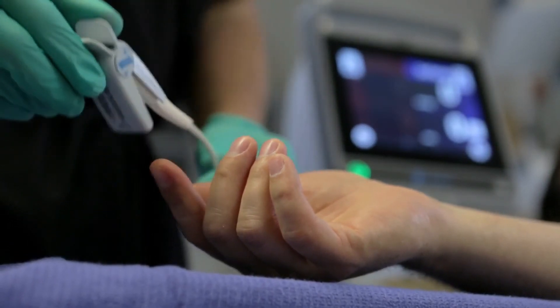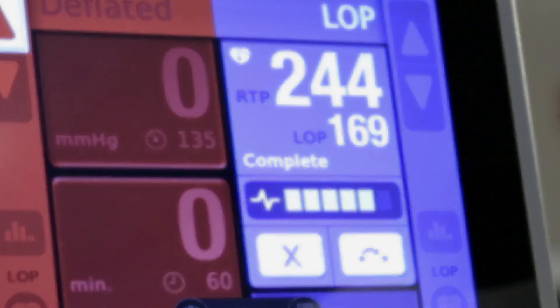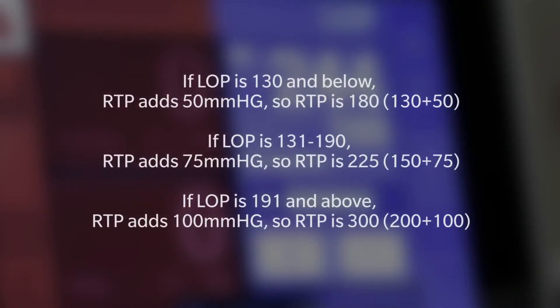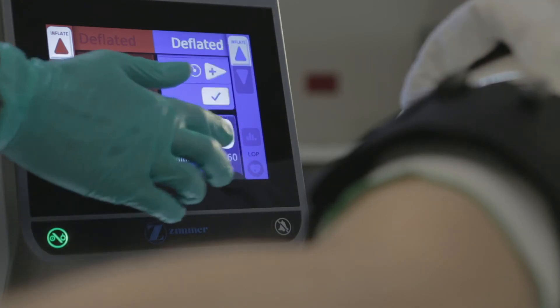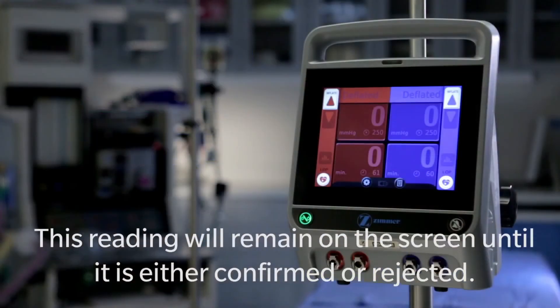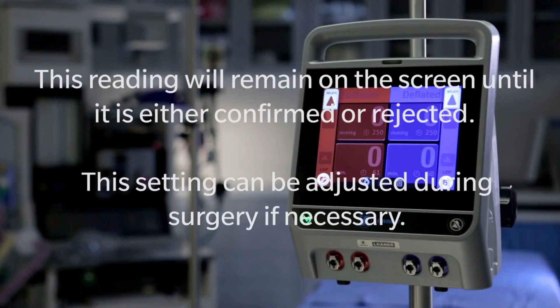The LOP pulse sensor can then be removed. Using the LOP reading, the unit determines the recommended tourniquet pressure, or RTP, expressed in millimeters of mercury. In calculating the RTP, the unit includes a pressure margin in addition to the limb occlusion pressure. This feature helps ensure that blood occlusion in the limb is complete even when blood pressure fluctuates during the surgical procedure. To accept the RTP, tap confirm and then tap confirm for the pressure tile. This reading will remain on the screen until it is either confirmed or rejected, and the setting can be adjusted during surgery if necessary.